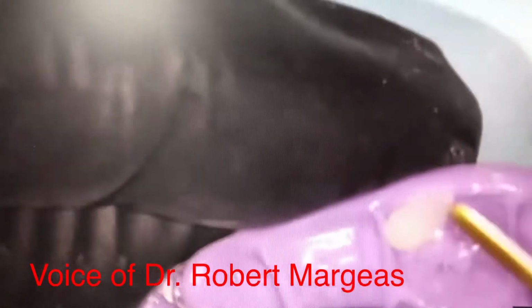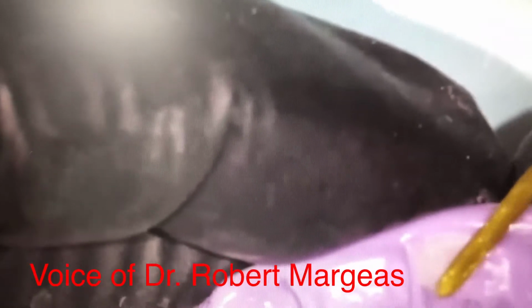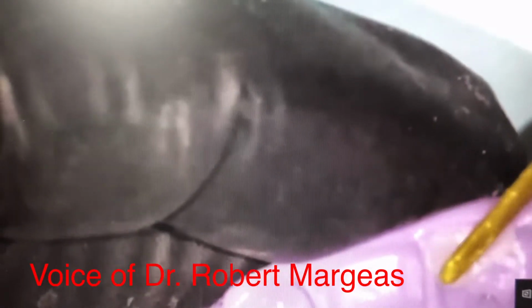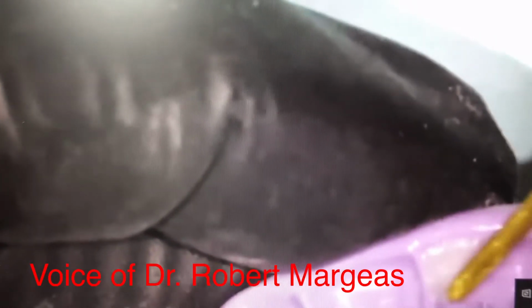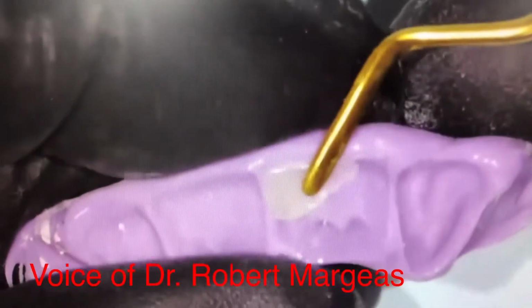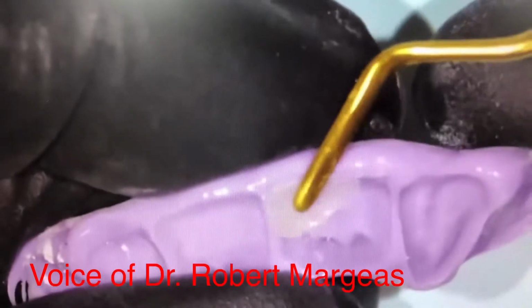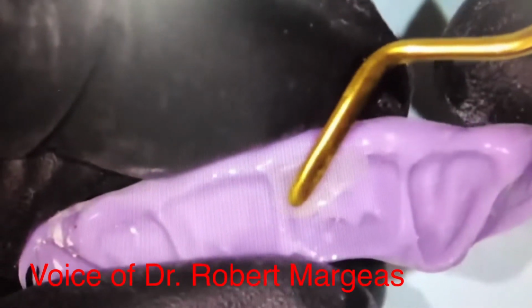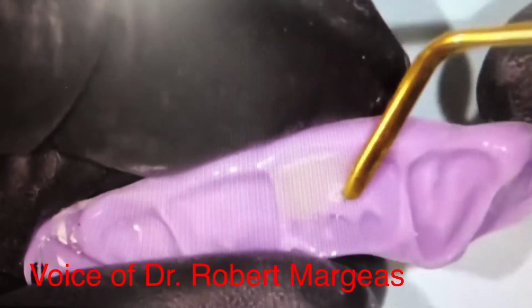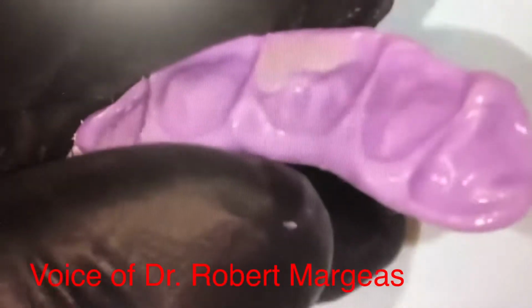So I then take my REJ4, place this into my lingual matrix, and I'm just trying to capture that lingual bevel. And this is a very, very thin layer. Okay? Very, very thin. All I want this to do is be a rampart for my next layer. You'll see here it's very, very thin. I placed it very, very thin, and then I can take this to the mouth.